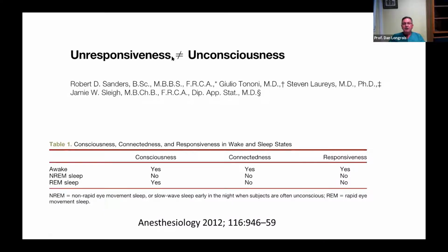framework is that unresponsiveness is different from unconsciousness. We imagine that if a patient moves, he or she becomes conscious. This is totally wrong. So one can be responsive and still be unconscious. And because of this difference between unresponsiveness and unconsciousness, it becomes mandatory to look differently at the monitors.